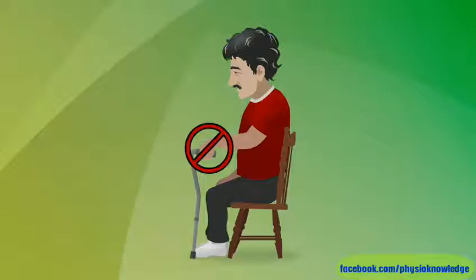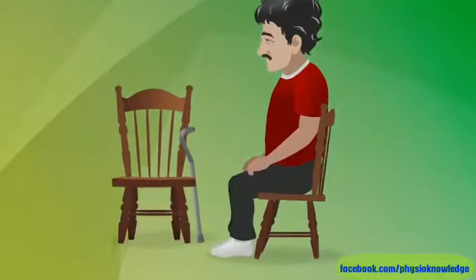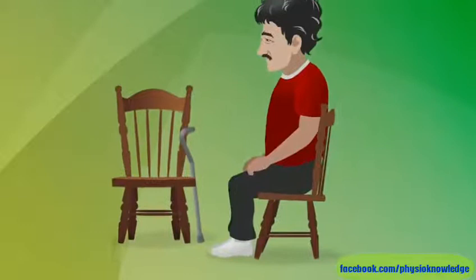Never use your cane to help you stand up or sit down. Instead, keep it close so it's easy to reach. Then put your hands on the sitting surface or arms of the chair to guide you as you slowly stand up or sit down. By learning how to use your cane the right way, you can move forward knowing you're doing all you can to stay stable and safe.